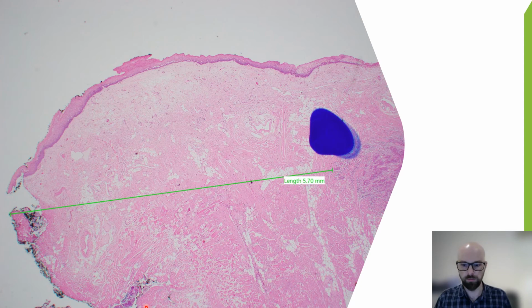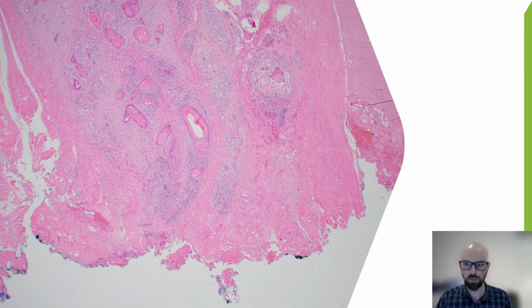Sometimes the tumour is a little bit closer to the margins, and then I do measure microscopically, like here. So we can see the tumour creeping into field here, inked margin on this side here, and then I've used the digital ruler with a camera to measure. Unfortunately, some cases the tumour does extend beyond where it was expected. Like here, we've got it going down towards the margin.